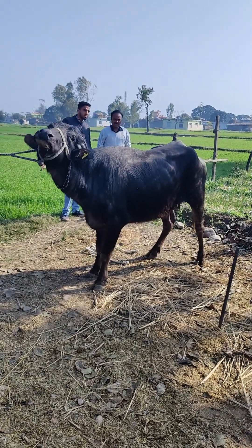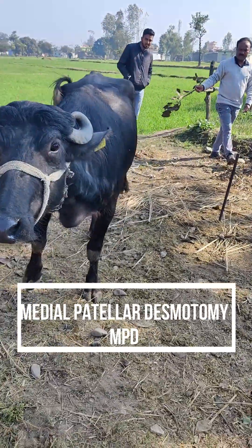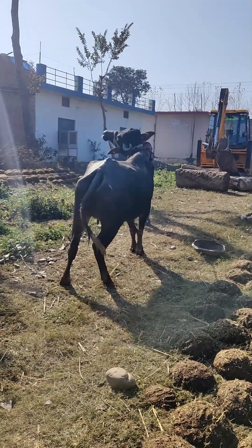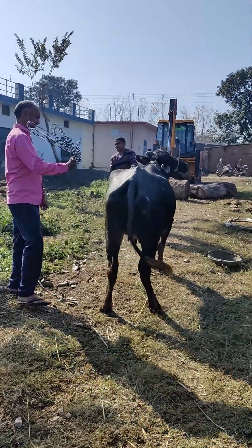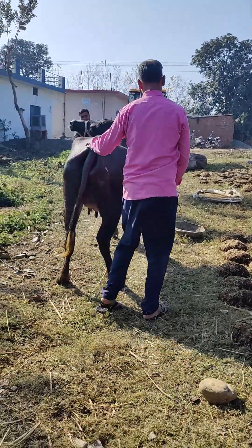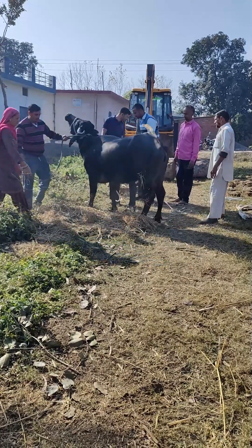This is a typical case of upward fixation of patella where MPD was done by closed method in the field. As you can see in the video, the animal is facing difficulty in walking. Here the preparation for restraining the animal is being done. As you can see, the ground is prepared before casting the animal on the ground for lateral recumbency.